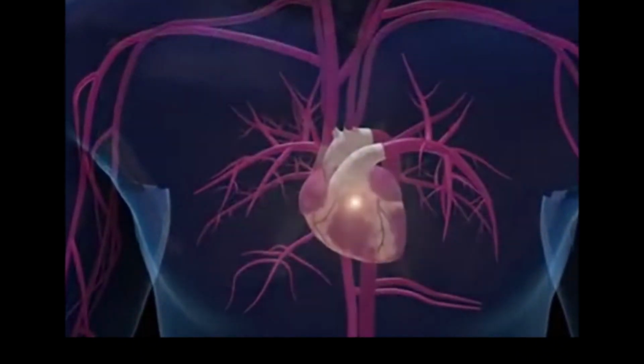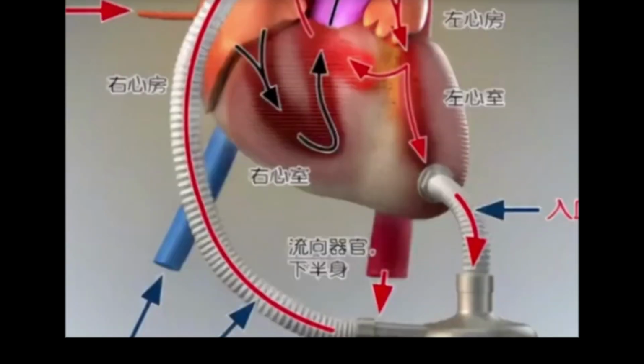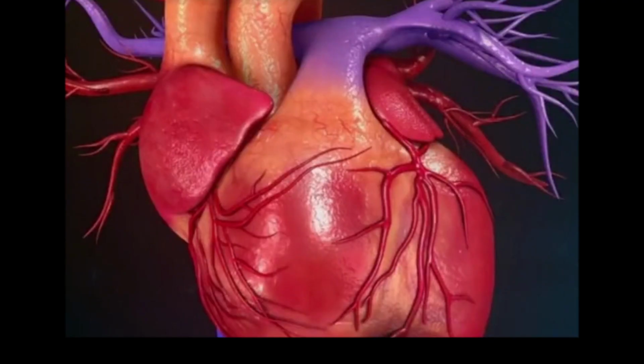The heart pump function of patients with heart failure is severely damaged, and there is not enough force to eject blood. However, an artificial heart, through a blood pump device, can help its own heart pump blood, allowing the patient's heart to rest fully. After a period of additional medication treatment, some patients' cardiac function can be restored to varying degrees, thus achieving the goal of rehabilitation.